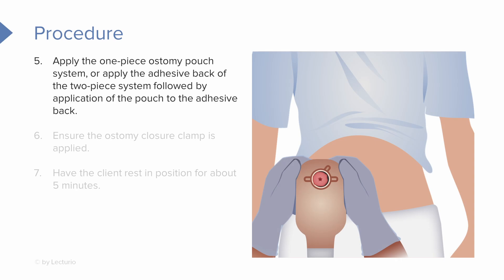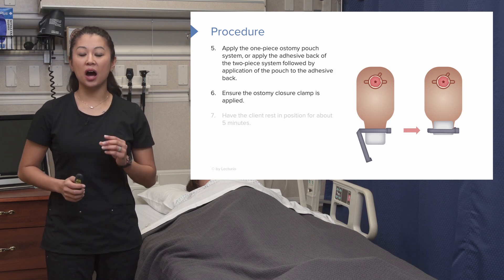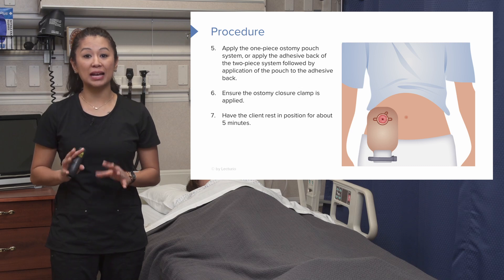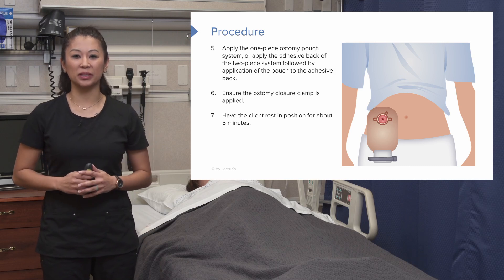Once we're applying the system — whether one-piece or two-piece — you're going to remove the adhesive back and apply it to your patient. If there's some pain when you apply pressure, you may want to attach the pouch to the wafer before putting it on the patient. Once you've applied your appliance, make sure the ostomy bag is closed using your clamp. Have the patient sit back and relax for about five minutes so we know the appliance is adhered safely and comfortably.